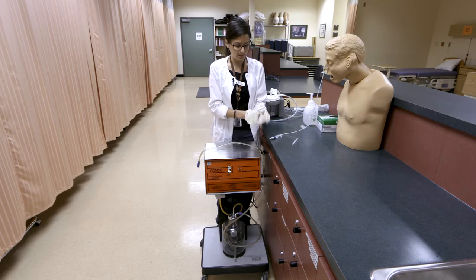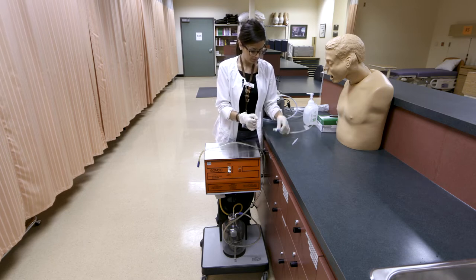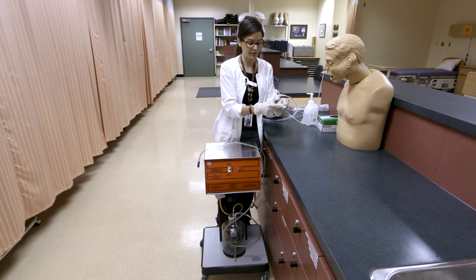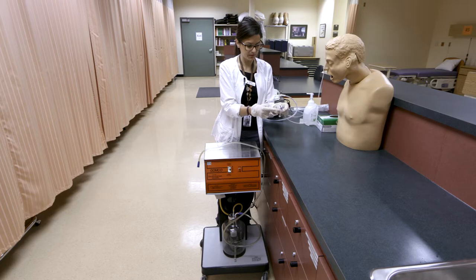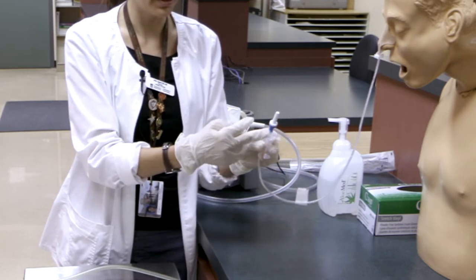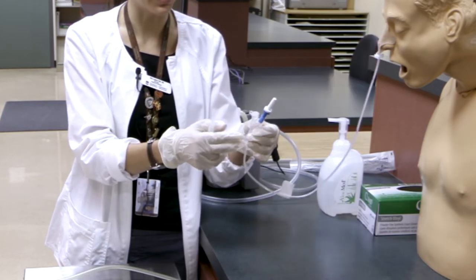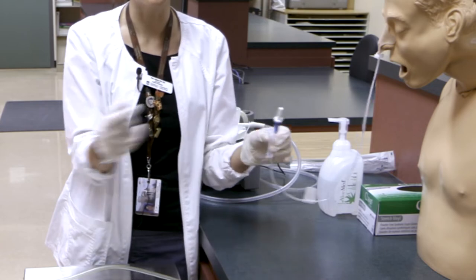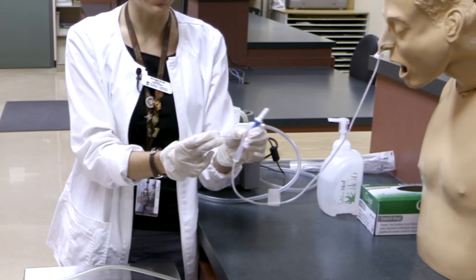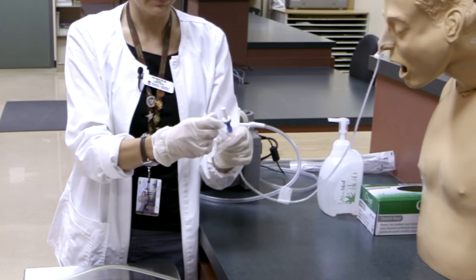I'll don my gloves, as we will likely come in contact with gastric contents. Open up the larger port. An important note: when opening these ports and caps, be really careful and gentle with them. You don't want to lose these caps. These tubes can stay in for up to 30 days, so you don't want to have to replace the tube because you ripped the cap off. They are a little flimsy and can be easily detached.